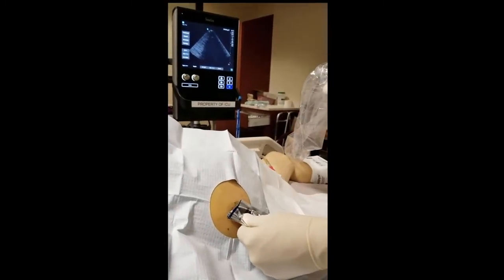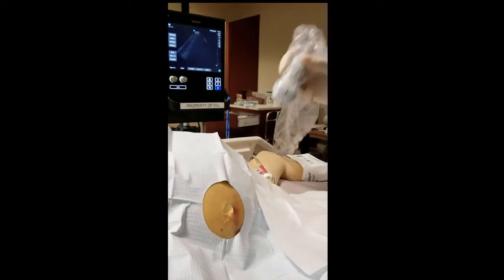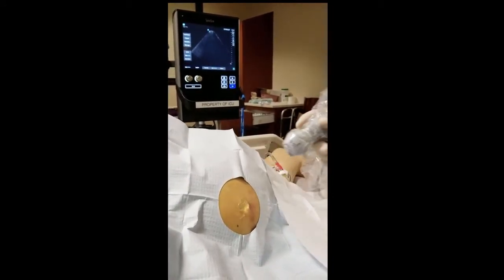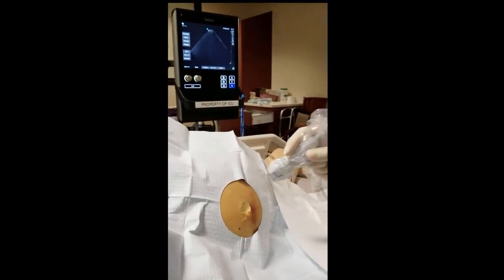We're going to choose our probe. Notice here that I'm choosing the cardiac probe, which is the low-frequency transducer, so that I have farther depth to look down on. I also want to know the top, so I'm looking here at the knob button, and that corresponds to up this way.